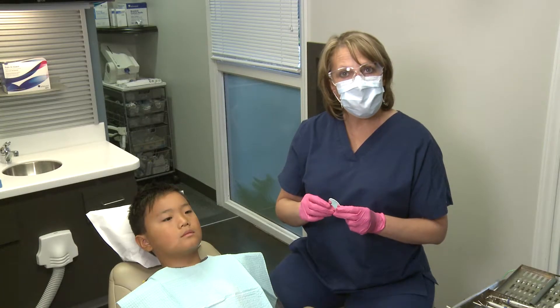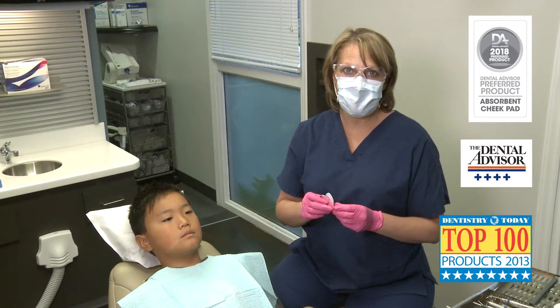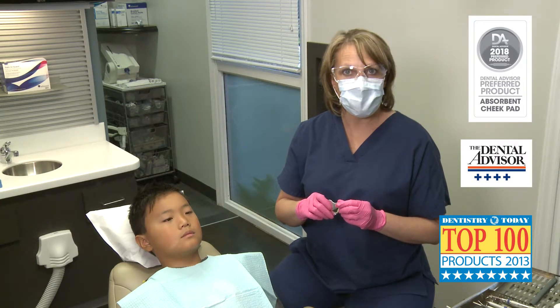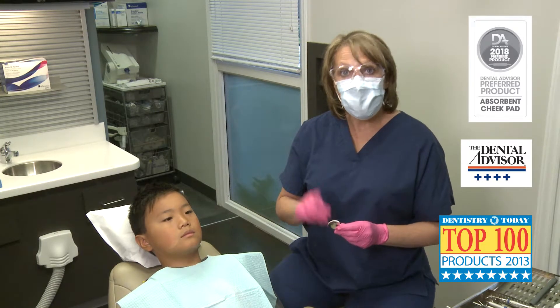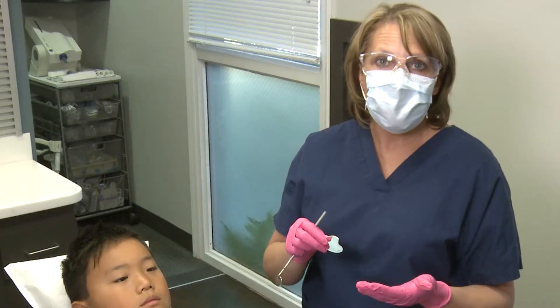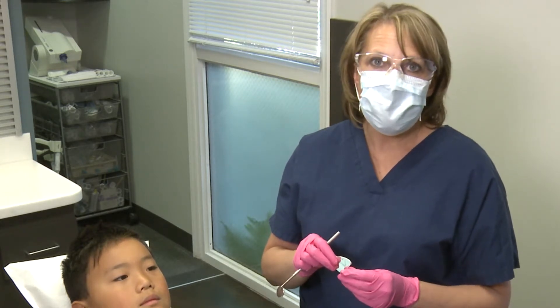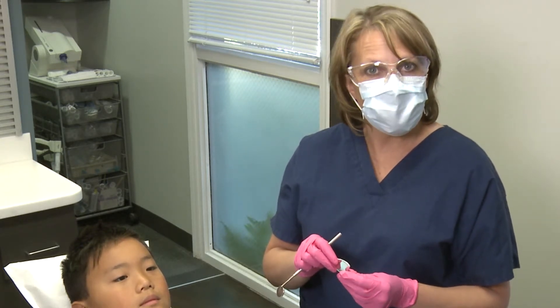The Reflective Shield Plus, which are a Dental Advisor's preferred product and a Dentistry Today's Top 100 Products winner, are so absorbent that one shield will absorb for the entire procedure. Saliva must be kept at bay in order to maintain a dry field, and this saves a lot of steps and hand motions for the dental professional.